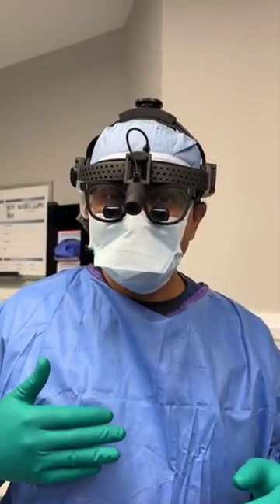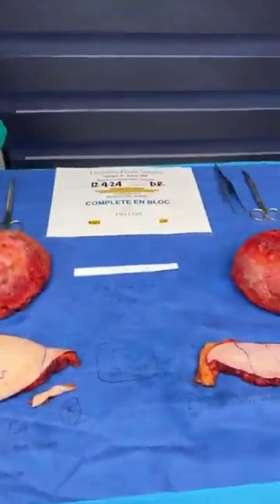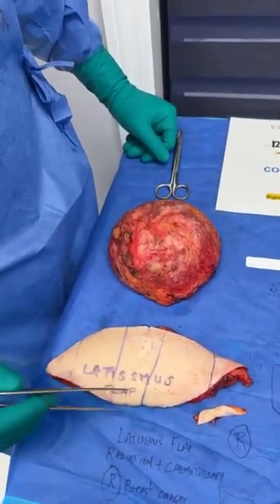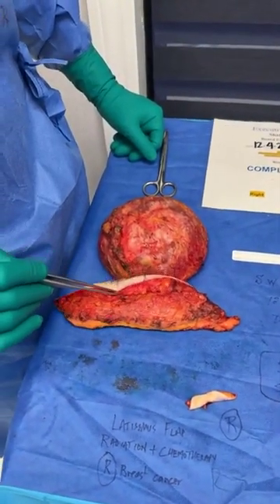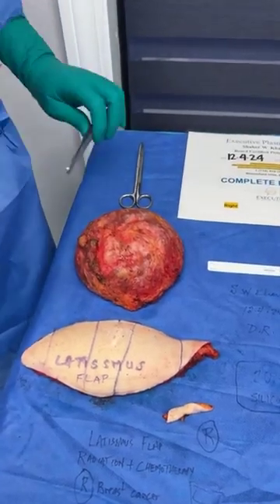And she had 650 cc's on the right and 800 cc's on the left. And so as you will see, this is your latissimus flap. You can see the artificial nipple, and you can see it is relatively much thicker. And this was, remember, on the back, and it was rotated out. So all of this was removed. Remember, she is going to have an aesthetic flat chest closure.